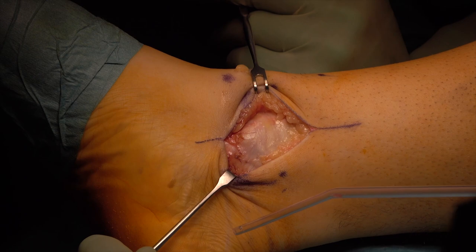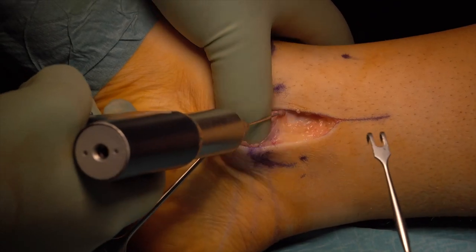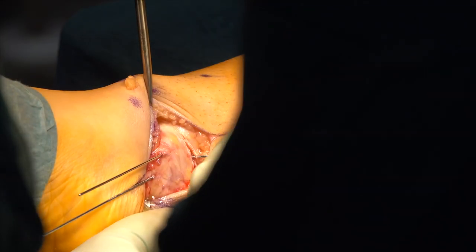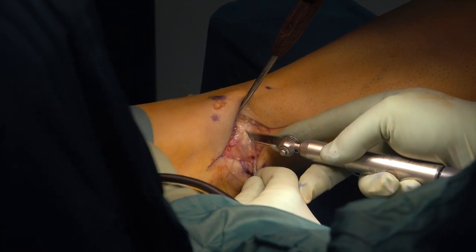Access is made via a medial malleolus osteotomy. After a longitudinal incision over the medial malleolus, K-wires are set under fluoroscan control and screw holes for the malleolus reattachment are prepared. The osteotomy is performed with an oscillating saw and completed with the osteotome.